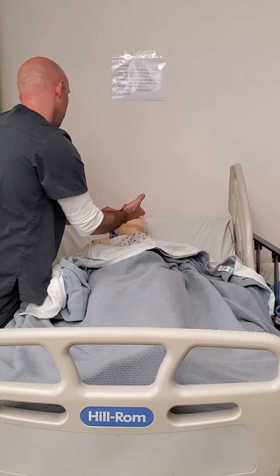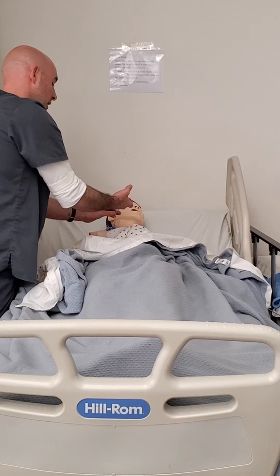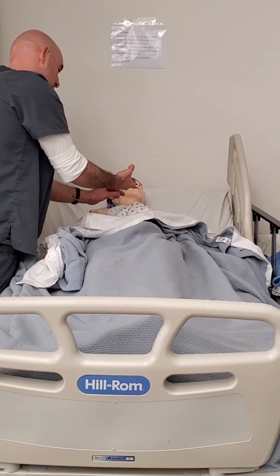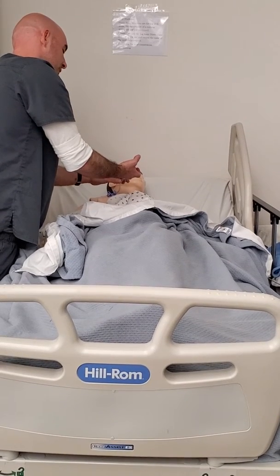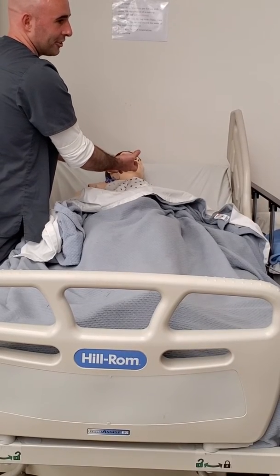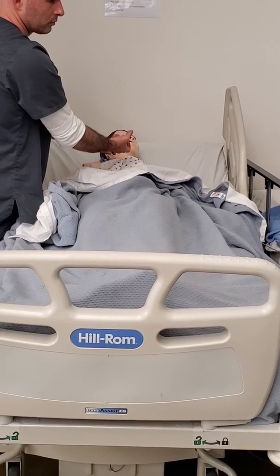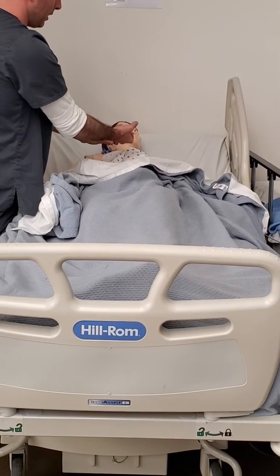And then I'm gonna do a push pause to assess for any occlusion. I'm gonna do push pause, assess for occlusion. Do you have to push pause to assess for occlusion, or would just pushing assess for occlusion? No, I want to push pause because if I'm doing that, then I'm gonna feel if there's resistance.